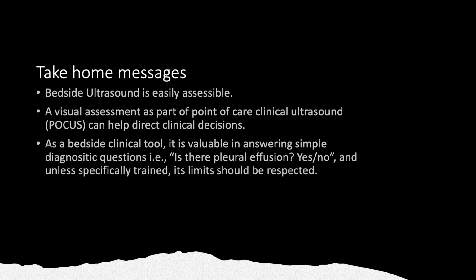Lastly, take-home messages. So bedside ultrasound is easily accessible. You just need to have those skills and a little bit of practice to be able to use it. A visual assessment as part of a point-of-care clinical ultrasound, or a POCUS, can help direct clinical decisions, as it did for me in the middle of the night. And as a bedside clinical tool, it is valuable in answering simple diagnostic questions or questions that will help you in determining treatment for the patient. For example, is there pleural effusion? Yes, no. And unless specifically trained, its limits should be respected.